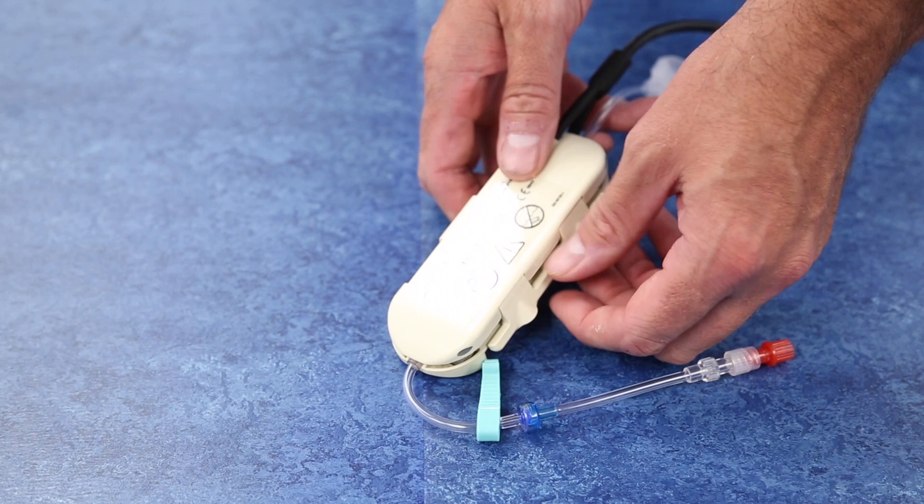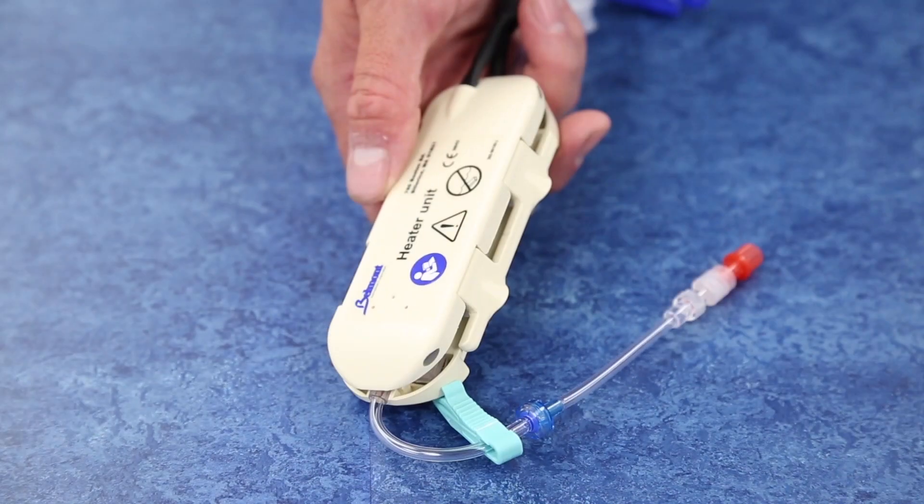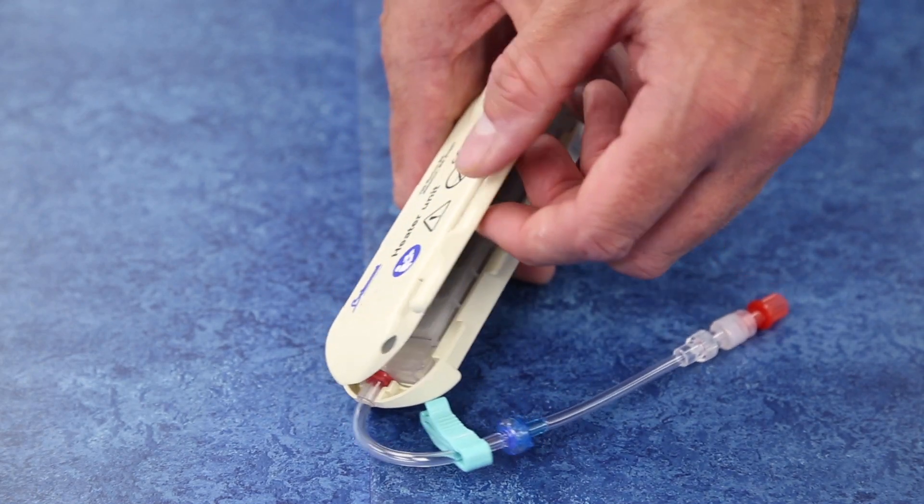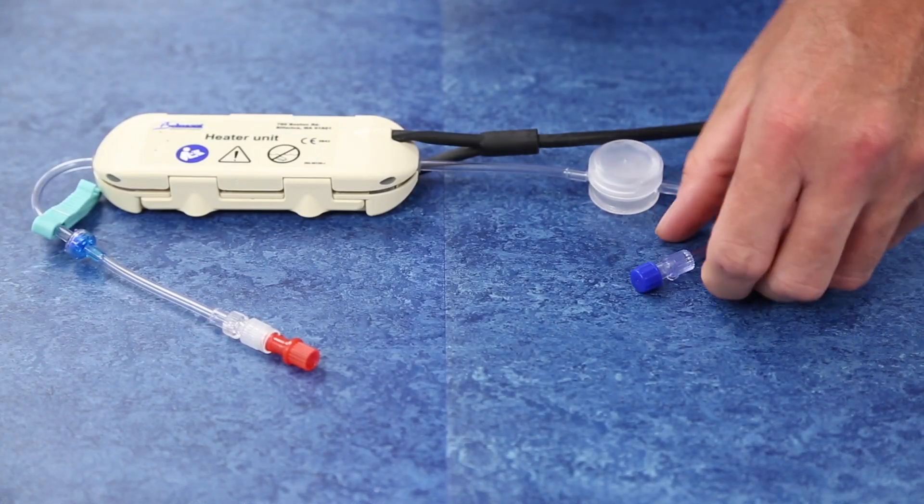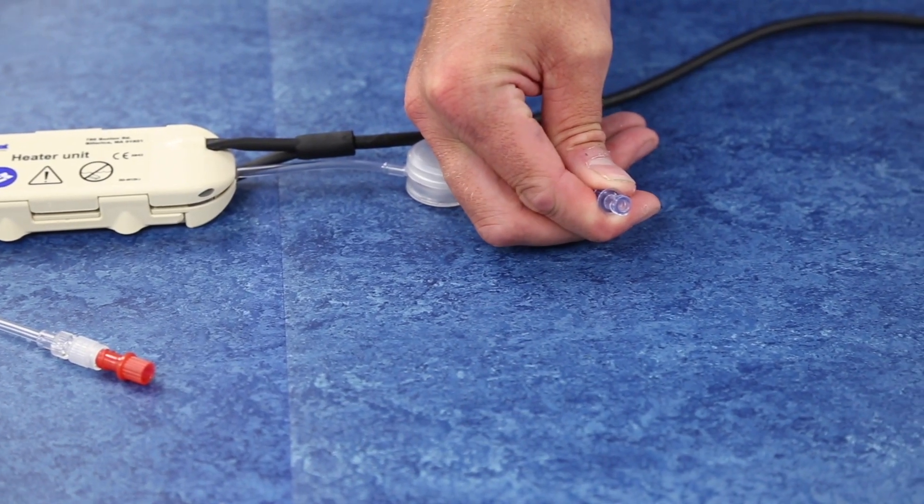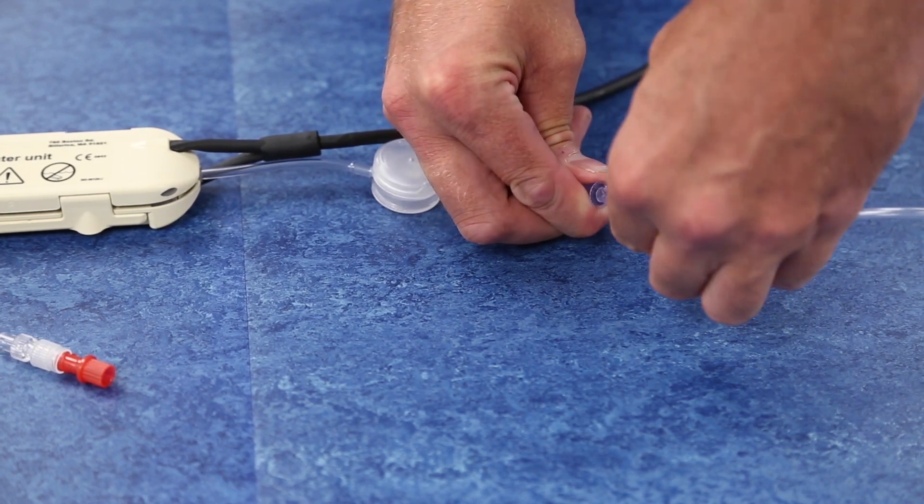Close and latch the heater door. Do not force the door closed. If the disposable is incorrectly positioned, the heater unit will not close properly. As a last step before moving to priming, disconnect the blue lure cap from the buddy disposable and then connect any administration set to that lure fitting.